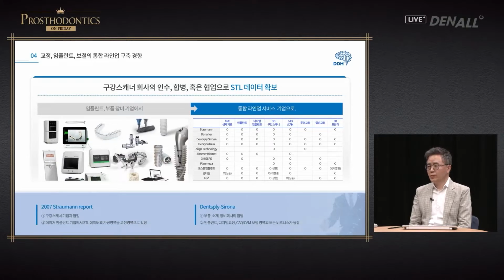However, with the introduction of the oral scanner, everything changed as the data transferred into STL files. Global companies rushed to either develop their own oral scanners or to buy oral scanner companies. There was so much to do with the scan data. Companies rushed to become implant companies and digital orthodontic treatment companies. In other words, with the introduction of intraoral scanners, the different divides within the dental field became obsolete and M&A were accelerated.